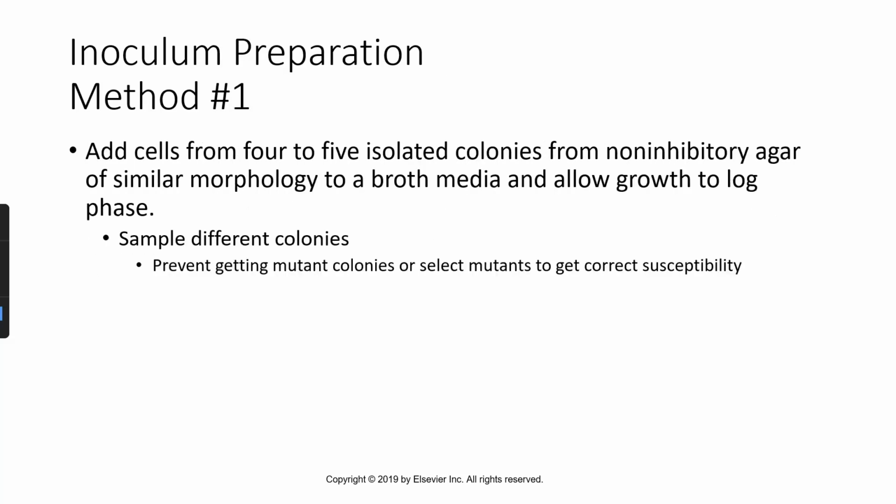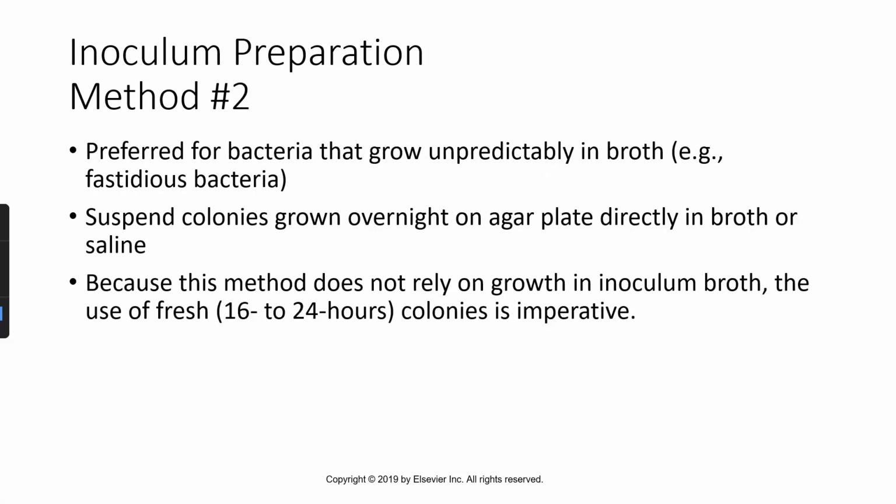So with this first step, you're isolating colonies, then you're growing them, then you're using them. In this step, you're isolating colonies and using them directly. So this step does cut out some time.